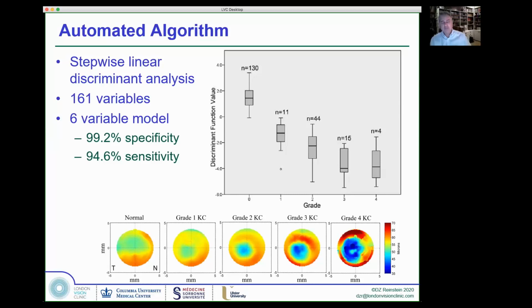Well, because tomographic changes that are detecting curvature changes, the signal to noise ratio of an abnormality versus background noise is going to be a few microns, let's say. Whereas because we can measure the epithelium with 1 micron precision, even a micron of abnormal focal inferior thinning, which obviously shouldn't be there, can seriously up the suspicion of detecting an early keratoconus.